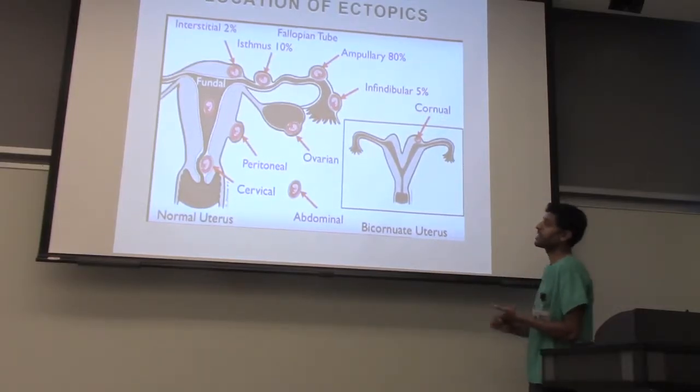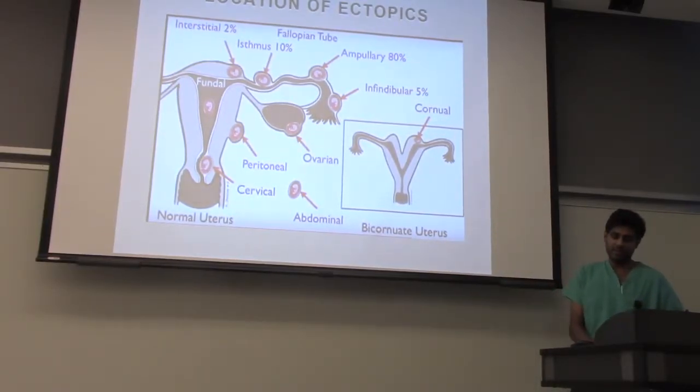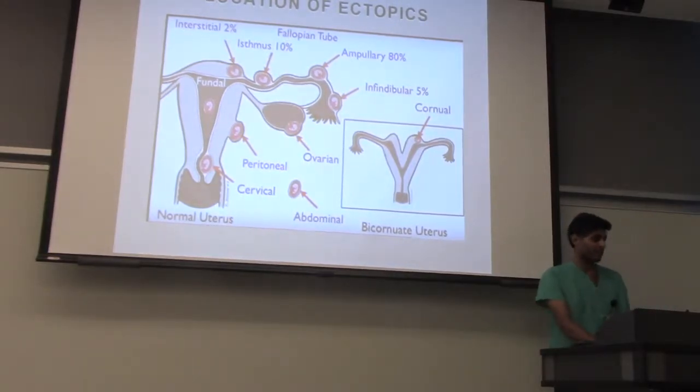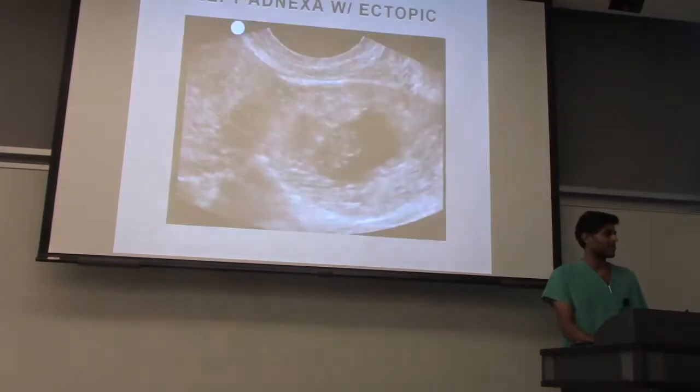If you still fail to identify an obvious ectopic, and the patient has an empty uterus, that's very, very concerning for an ectopic pregnancy that just hasn't been identified. And the OB service needs to be notified. This patient most likely should not go home and should have a repeat scan done. So that's kind of the appropriate escalation of services.